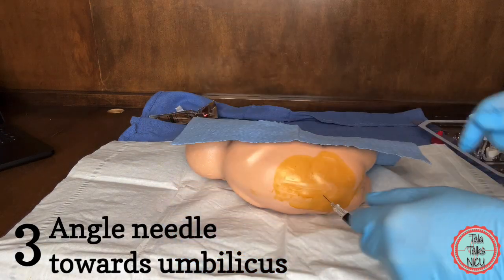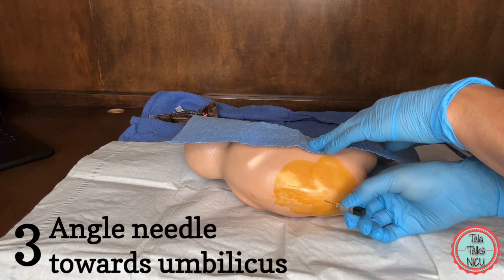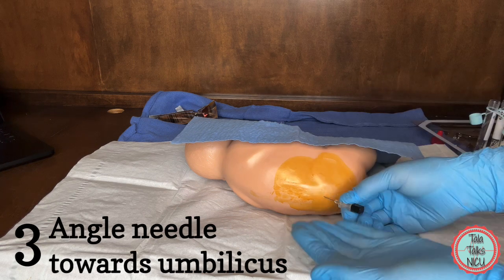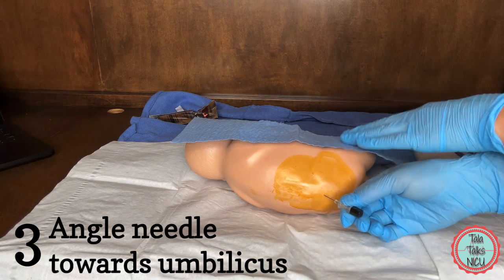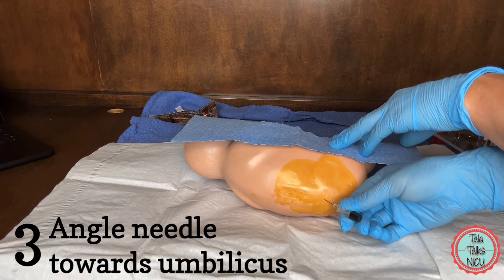Three: your entry point may be okay but you're angling the needle wrong. Make sure that the needle stays parallel to the surface. You're aiming it towards cephalad — so towards the umbilicus or the head.